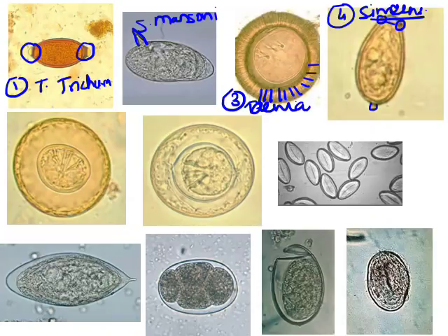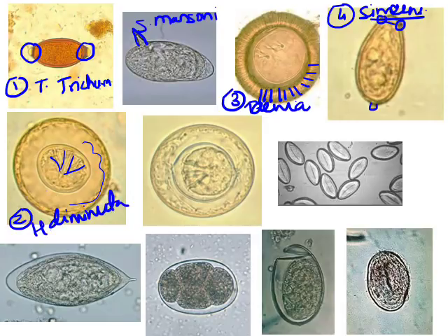What egg is this? Here we see the hooklets within the egg. So it's a cestode, but there are no polar filaments. It's a clear space. So no polar filaments, so diminished, that is Diminuta. So this is H. diminuta. This again you see the hooklets, so a cestode, but there are polar filaments, so this becomes H. nana.